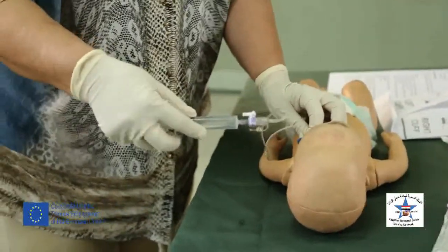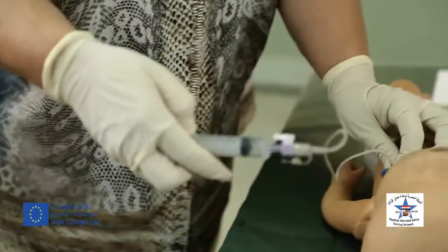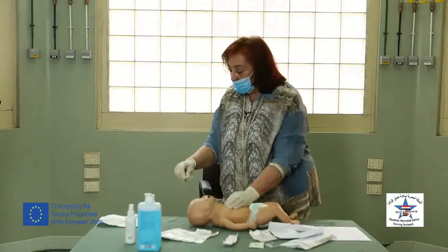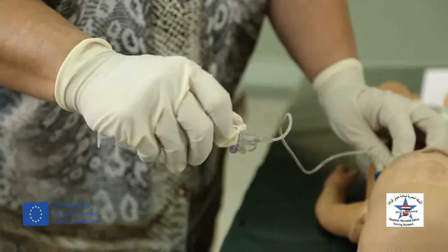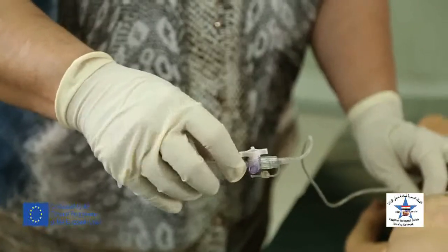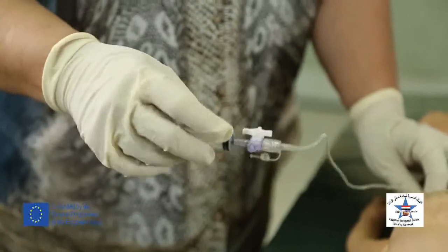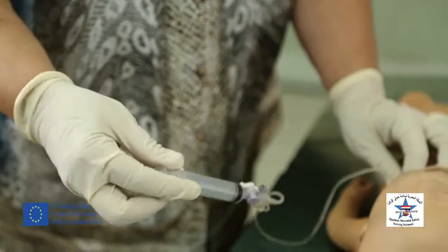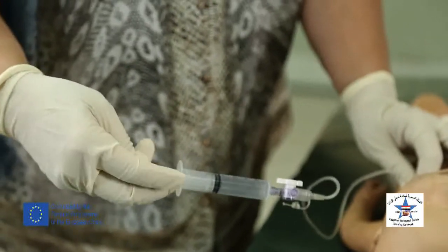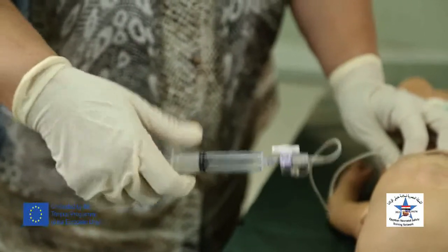I will push the air out, and then again I will redirect the three-way so that the butterfly is in one direction with the 10 cc syringe, and I will repeat the process of withdrawal of air again until the syringe is full.